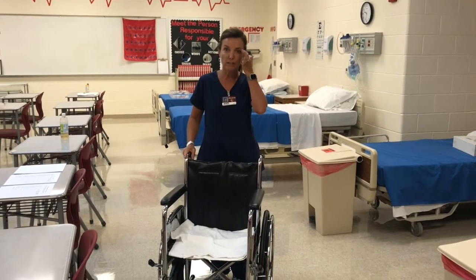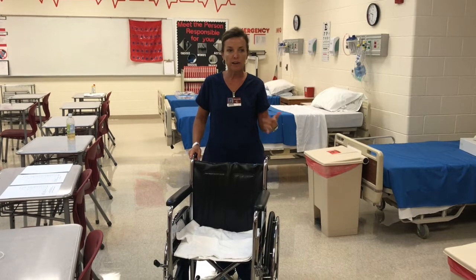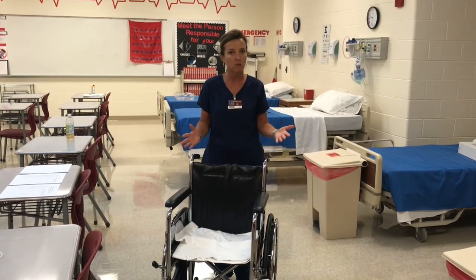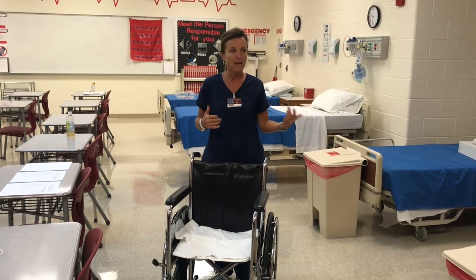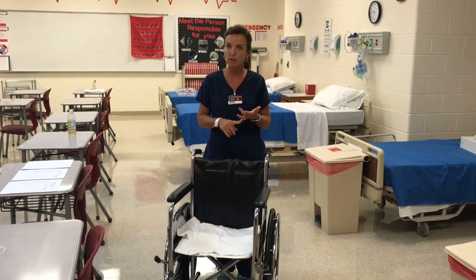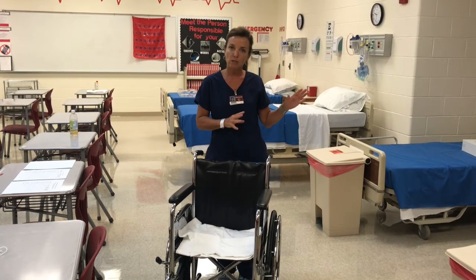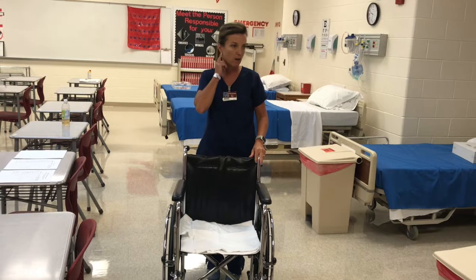We've talked about pre and post procedure care guidelines in the classroom — these are things you're going to do for every patient regardless of the procedure. There are lots of safety checkpoints involved. For our demonstration today I'm going to show you the pre and post procedure care guidelines. Our assignment will be to take the patient to x-ray and we're also going to do wheelchair safety.